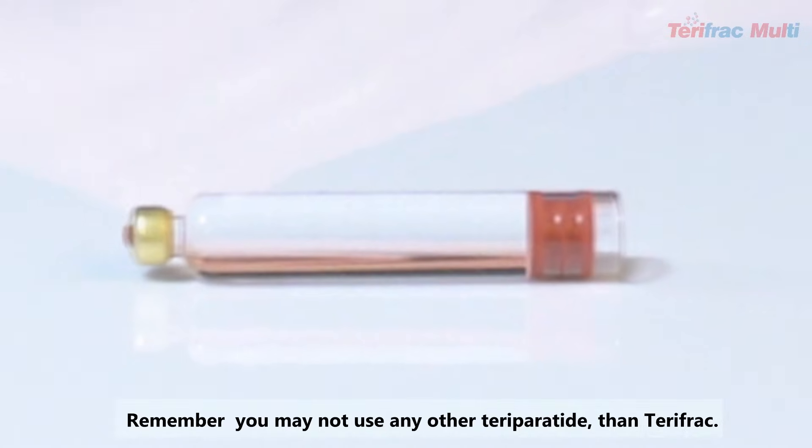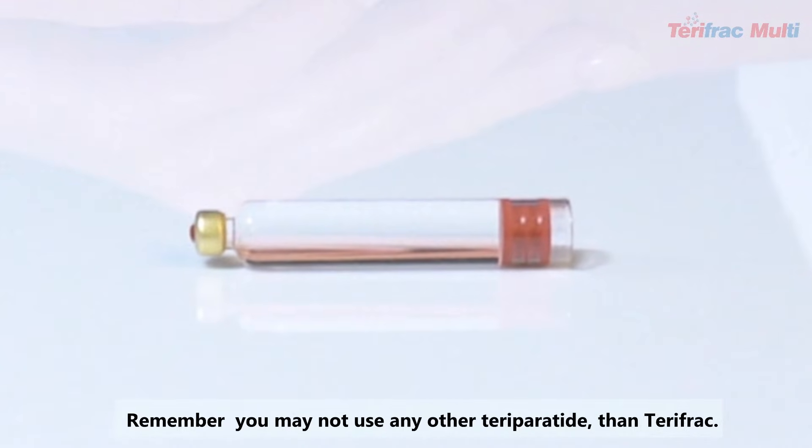Remember, you may not use any other Teriparatide cartridge than TerriFrac.